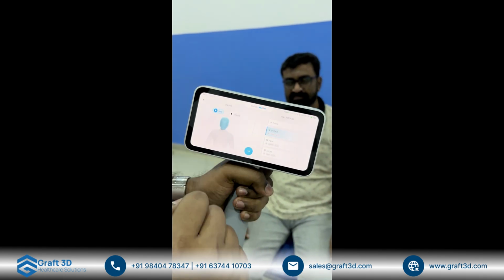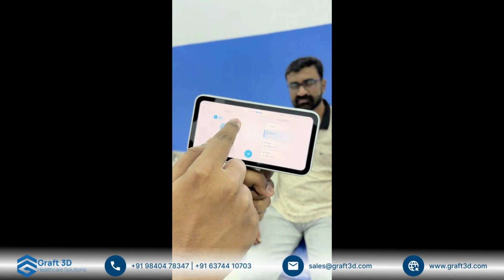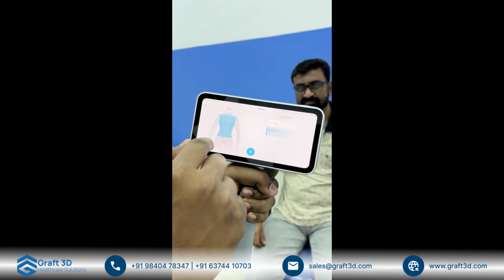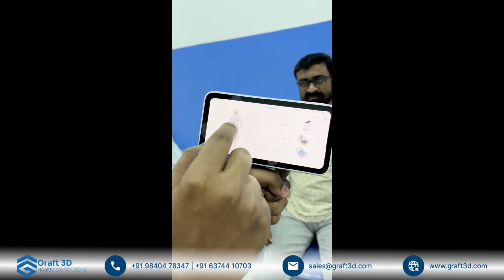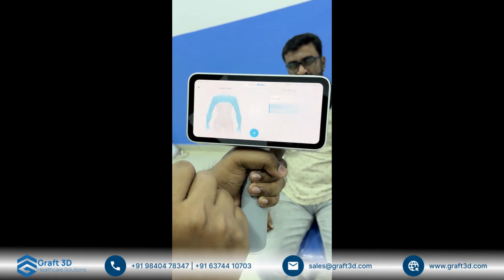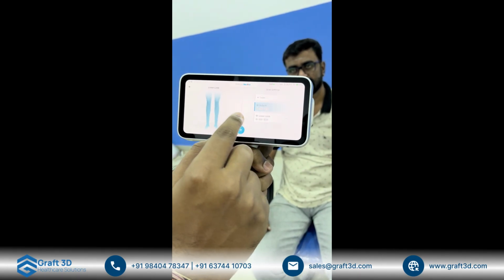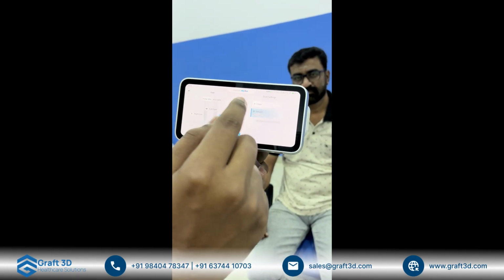So we have this where it will be scanning the face and the cranial. Another mode is the torso, where we're scanning the abdominal region. For that, we have a particular mode. For upper limb, we have a different mode. For knee, lower limb, we have a different mode. For the knee, feet, we have a different mode.